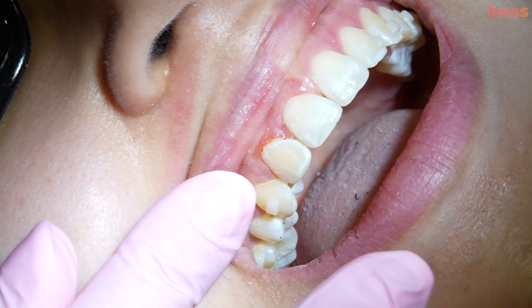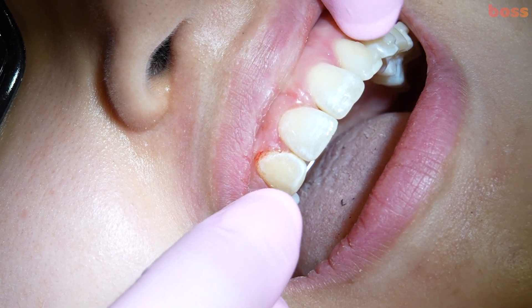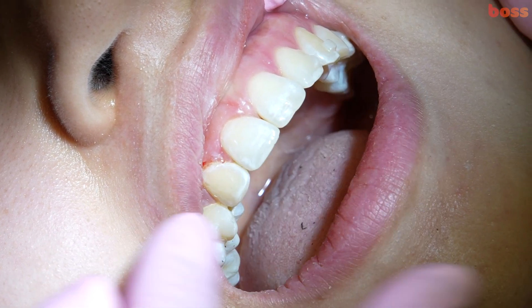What you're seeing here now is we've started to create a similar anatomy to that lateral incisor. We would also just reshape that slightly further.